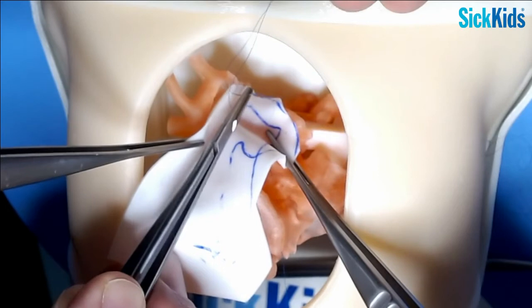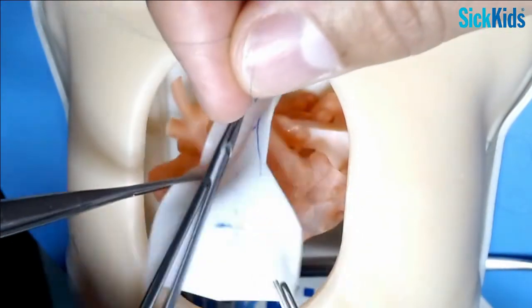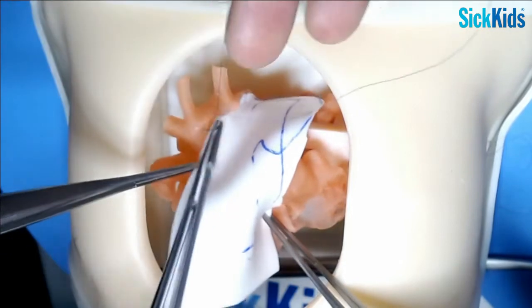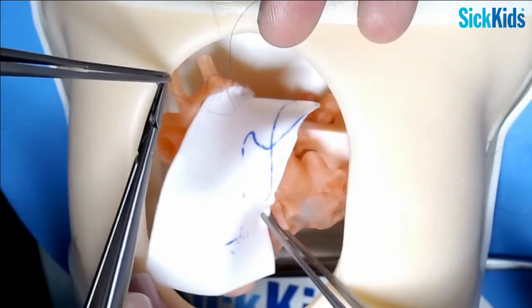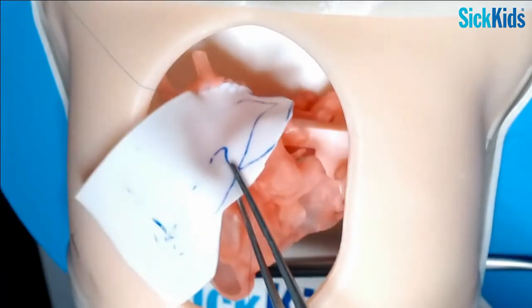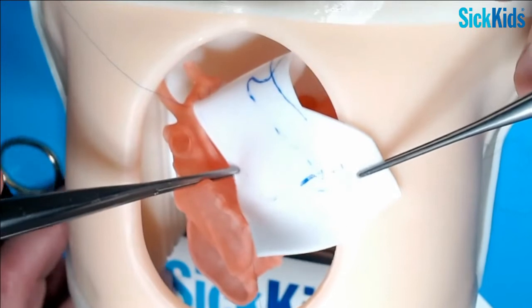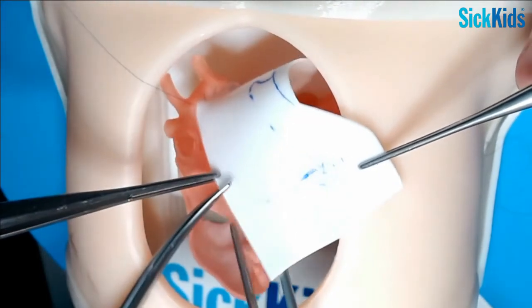So you want to bring this up to about the innominate. Okay, so we're up to about the innominate. Now you can decide how long this patch is going to need to be. So we'll fold it over. This is a Tom Spray maneuver, where you get to there and you put your little cut at the top of where that's going to need to be.